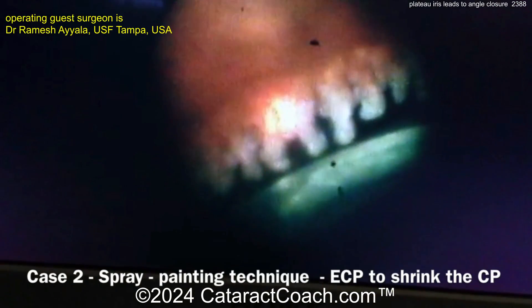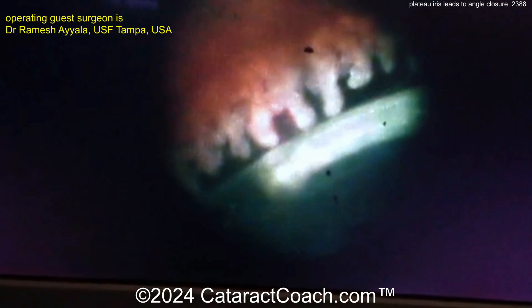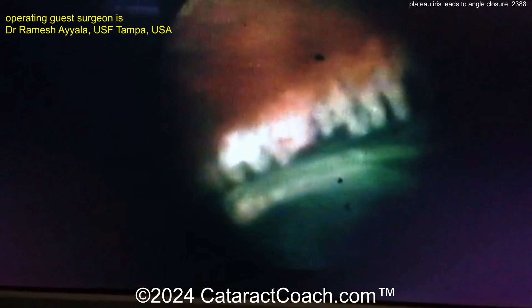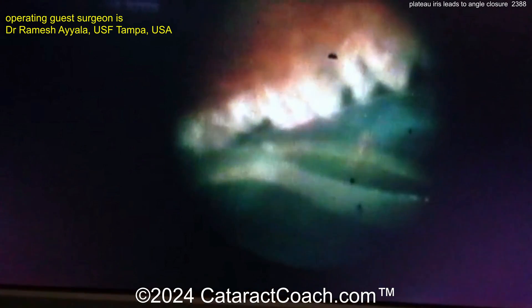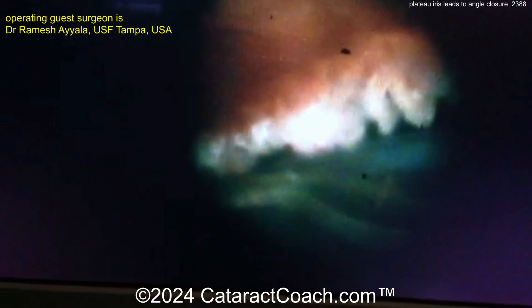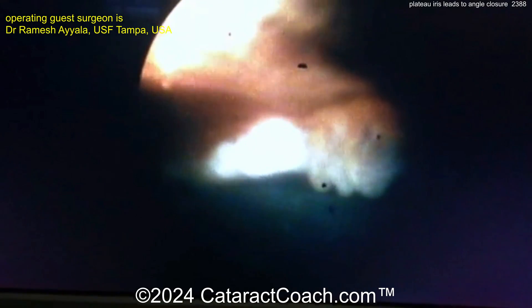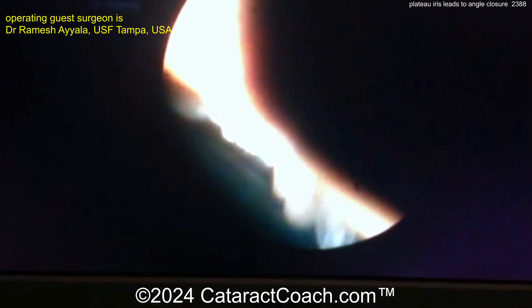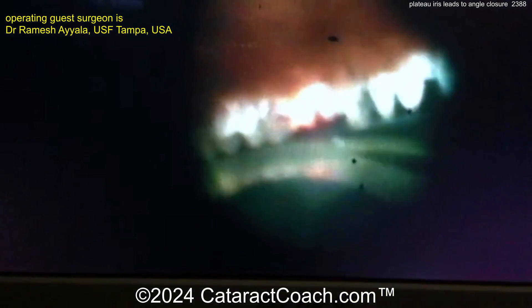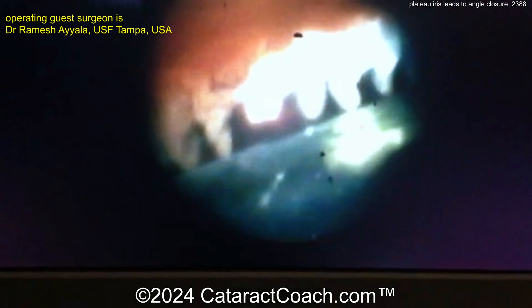These are complex cases. Here is another case showing the spray painting technique, where the ciliary processes are painted with the diode laser. Note the variation and differences in the size of the ciliary processes — no one really knows the significance of that size variation. The diode laser applied both on the processes and in the valleys helps reduce aqueous production and therefore reduce intraocular pressure.